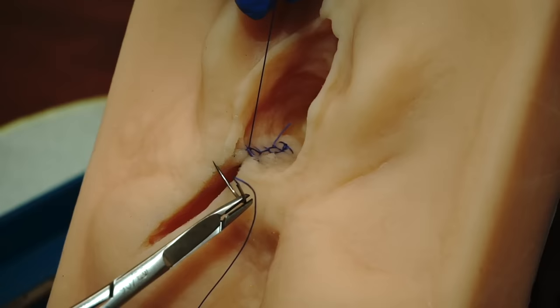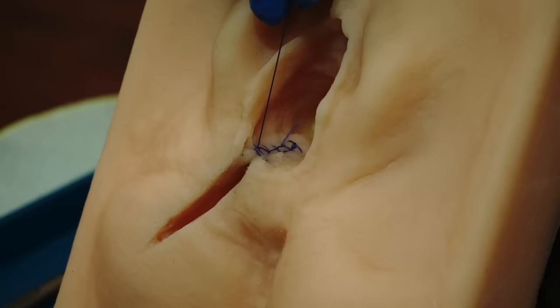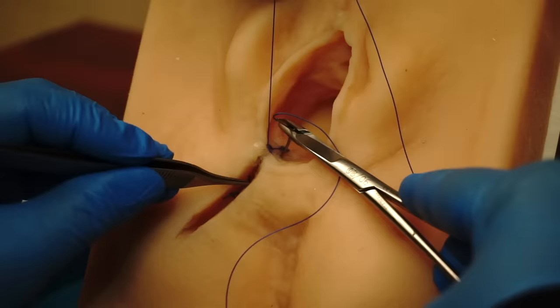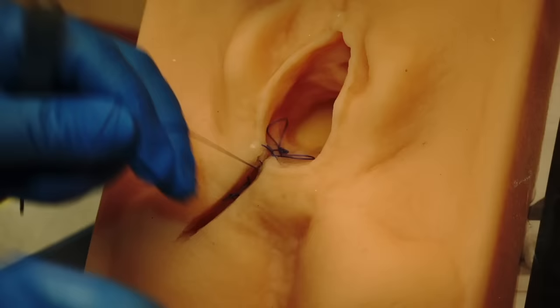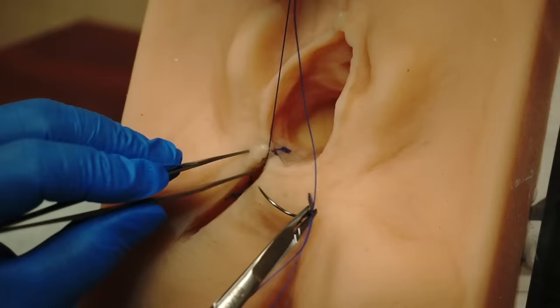I will be holding my needle driver like this and passing the needle in the deep tissue all the way across and coming out at the same level on the other side, basically pulling it through and placing my deep suture inside this perineal body. Now we're ready to do the crown stitch. We will bring this horizontal portion of the suture down into the vertical area into the perineal body just like that. We pass the needle into the posterior vaginal wall and now we are going to secure this horizontal stitch with the crown stitch.